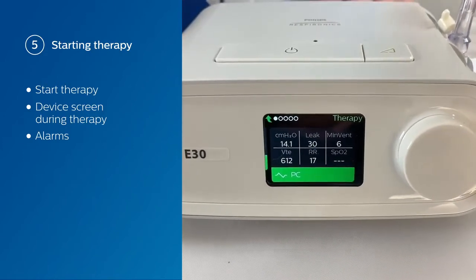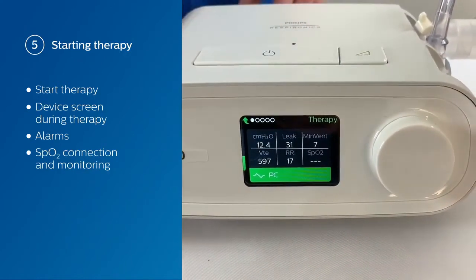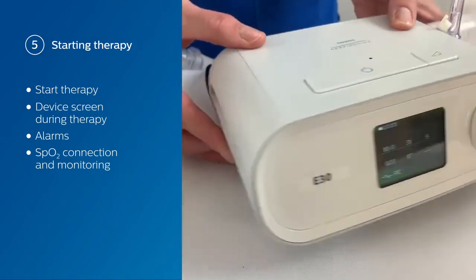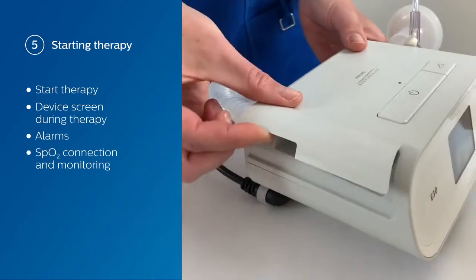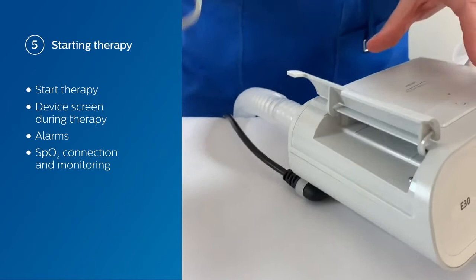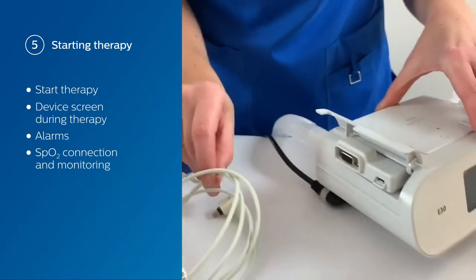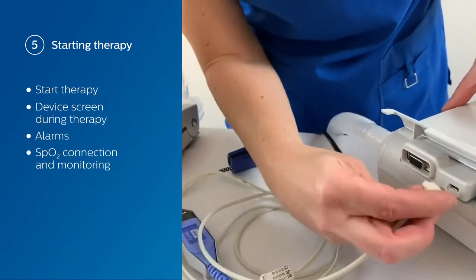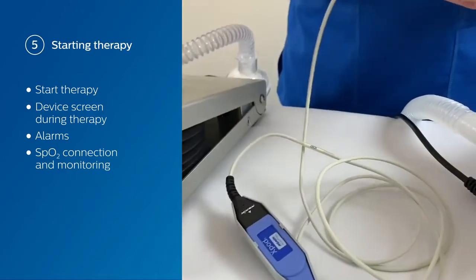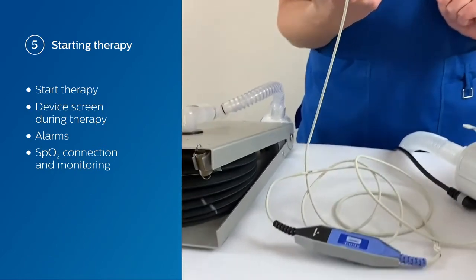You'll also notice on the screen that there is an SpO2 reading. At the moment there are three dashes because we don't have our SpO2 equipment connected. So we're going to rotate the device, open up the side door, and connect our SpO2 equipment. You need a link module, the Nonin X-Pod connector, and a finger sensor — all three pieces are required to get your SpO2.